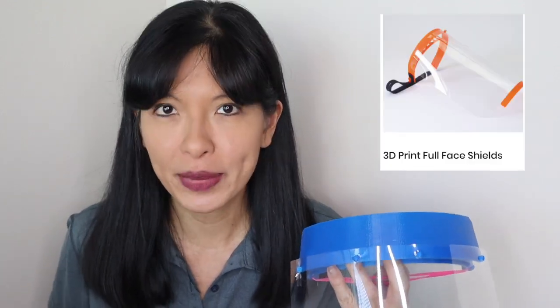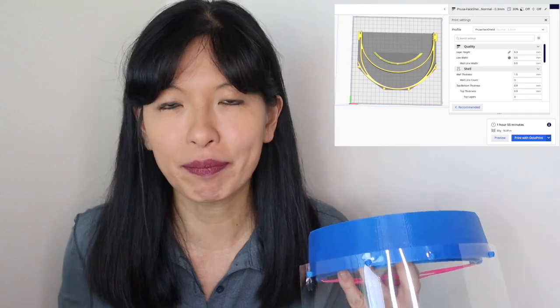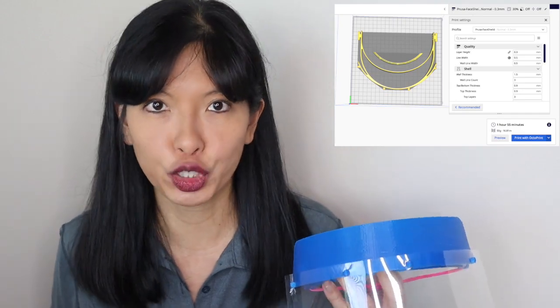On this video, I'm going to focus on printing the frames for the shields, where to get the designs, and my settings in Cura.